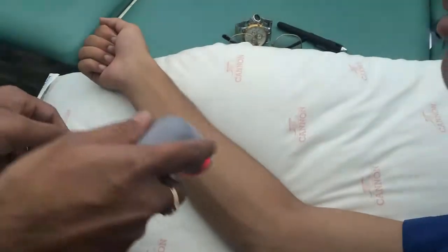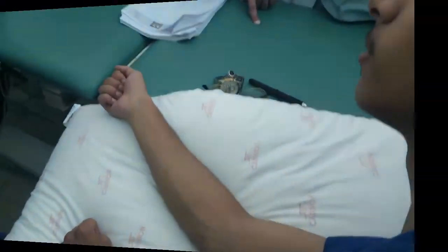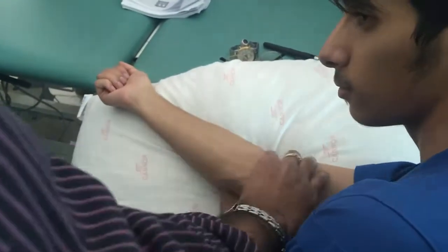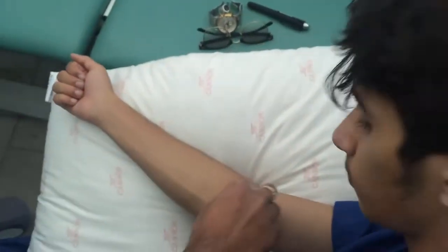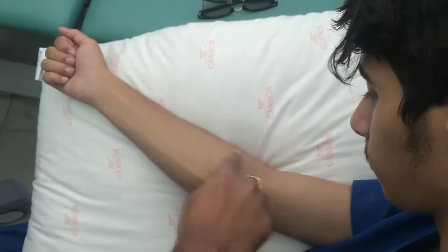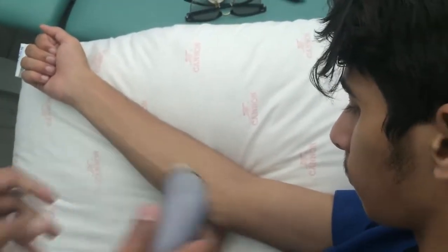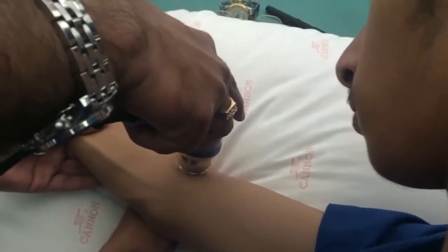You should hold it perpendicular. For example, if this patient is having pain here, I am using a grid technique. Grid means I am dividing this area into small boxes. I am just touching here for a few seconds.